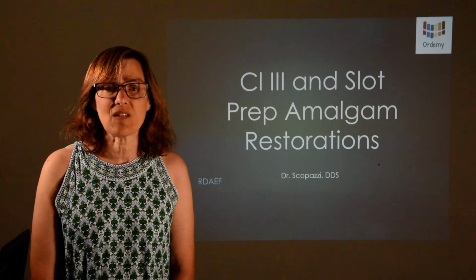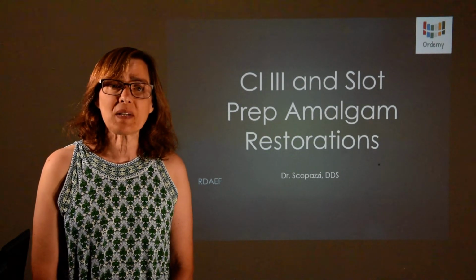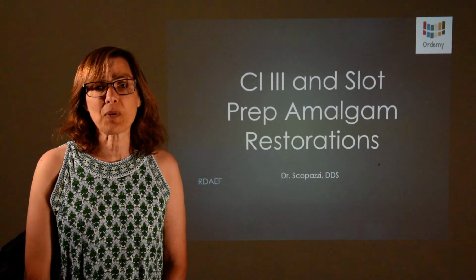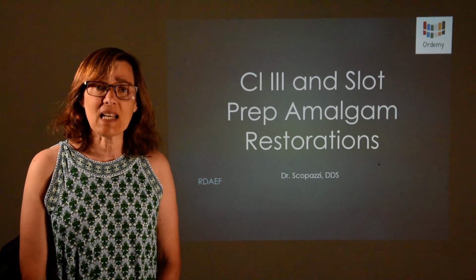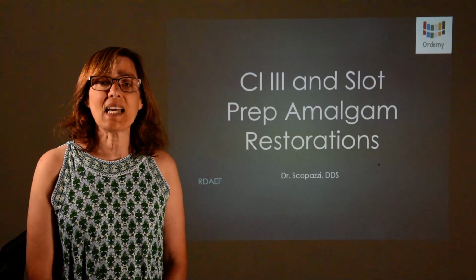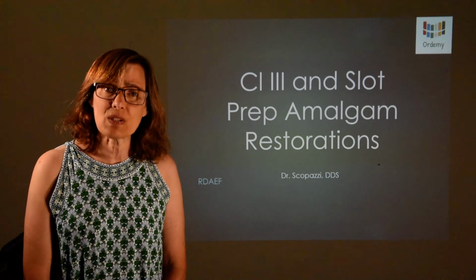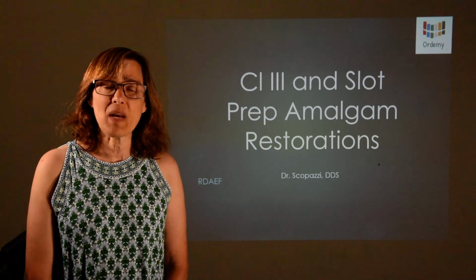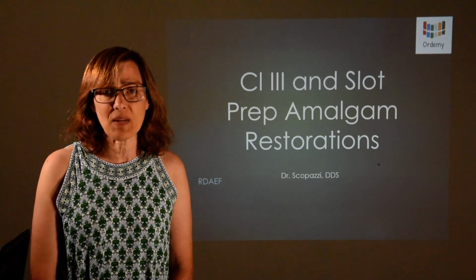Its color is a disadvantage, and some medical professionals believe that the mercury in the amalgam may contribute to some diseases like multiple sclerosis and others. I have to say that today there are still practitioners who feel that amalgam is an effective and useful restoration and still use it today. Other dentists remove all the amalgam in the patient's mouth and restore with the ceramics and composites that we have today.